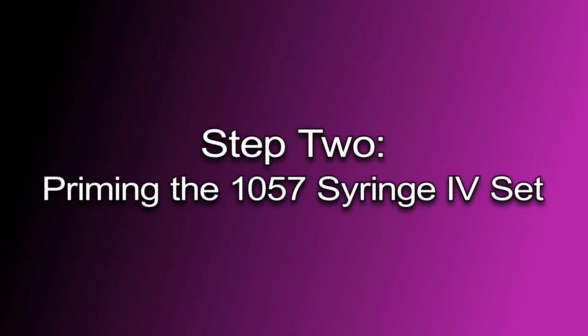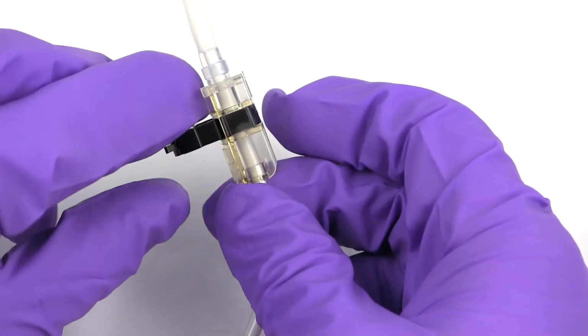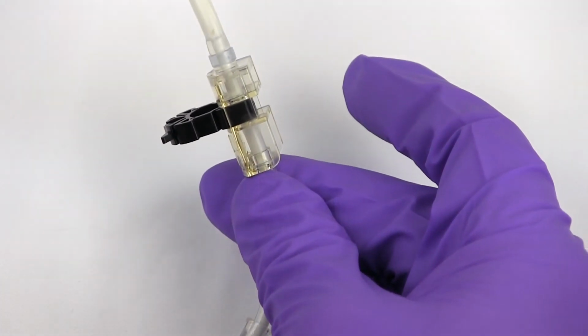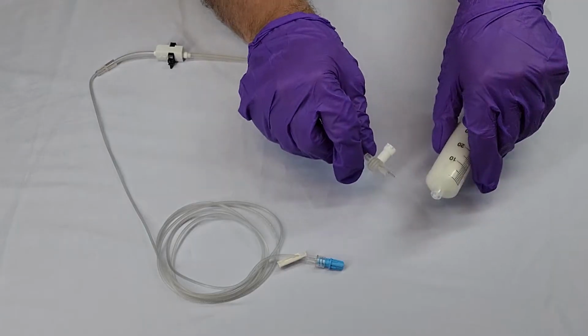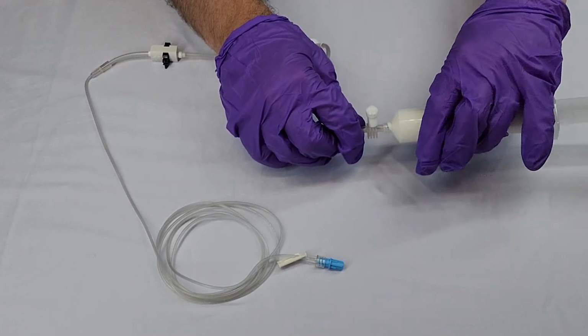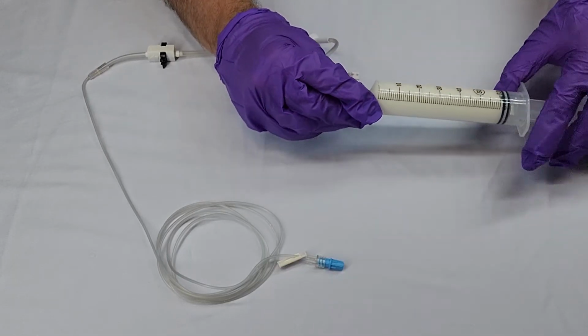Step 2. Priming the 1057 syringe IV set. For all IV sets, once the IV set is primed, the user will clamp off the black flow preventer clamp. Be sure the black slide clamp is pulled all the way out past the flush position. For the 1057 IV set, the user will pre-fill the syringe with medication to be infused. The user will then carefully attach the syringe to the luer fitting, making sure the stainless steel flow tube is sealed properly within the syringe, and slowly turn until the syringe is snug.